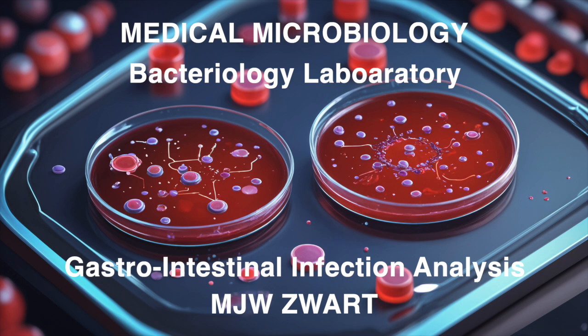Good point. Now, shifting gears to treatment, what's the main reason we do sensitivity testing when we have a GI bacterial isolate? Sensitivity testing tells us which antibiotic will actually work against that specific bacteria, so we can target the treatment and prevent resistance. Couldn't have said it better myself. It's all about personalized treatment for bacteria. Speaking of which, what are the 3 main methods we use for sensitivity testing in the lab? We have disk diffusion, the E-test, and VITEK 2. They each have their own quirks and advantages, but they all help us figure out how susceptible the bacteria are to different antibiotics. You're on fire.